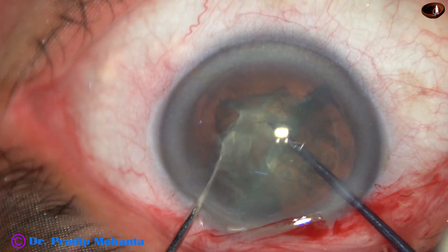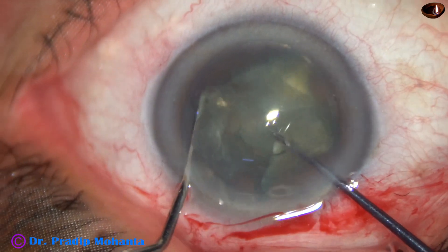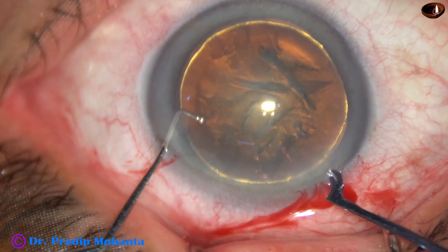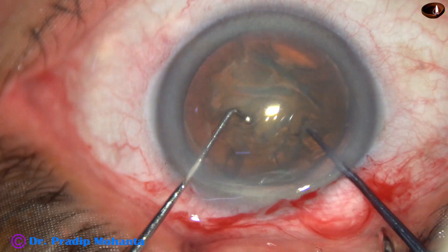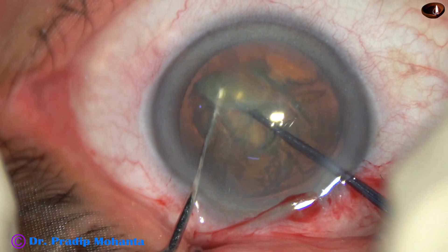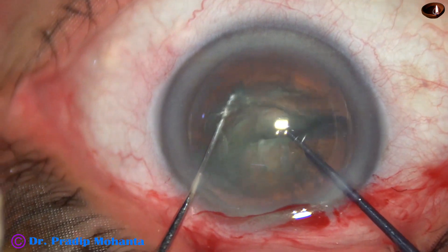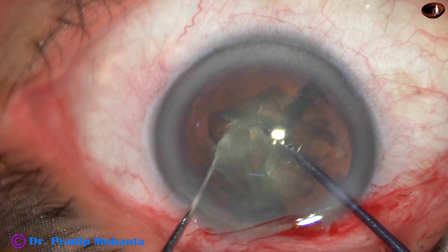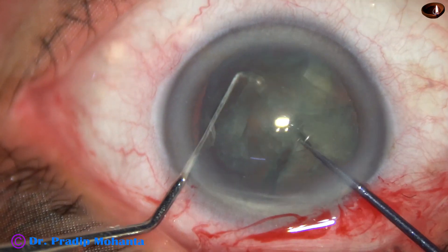In soft cataracts, if we try to hold the nucleus, we may just eat off the lens matter in front and may not be able to hold it. So in such cases, this pre-chopper helps. Observe in slow motion: the pre-chopper goes in just in front of the main incision. The sustainer hooks the other equator of the lens and the two instruments come near each other. As they almost touch each other, the lens matter is divided into pieces.